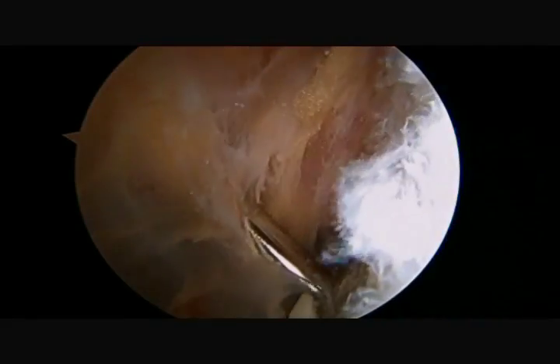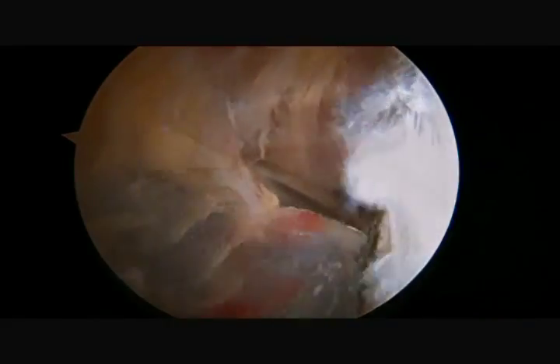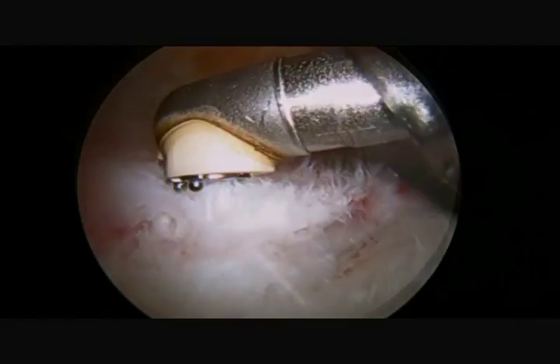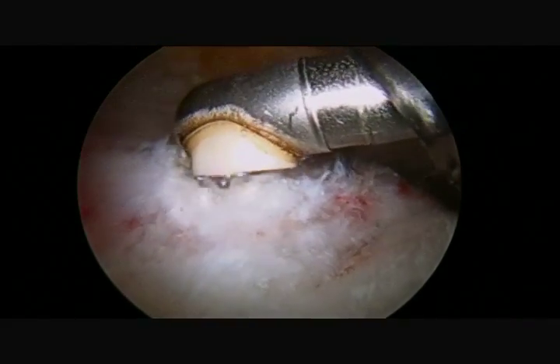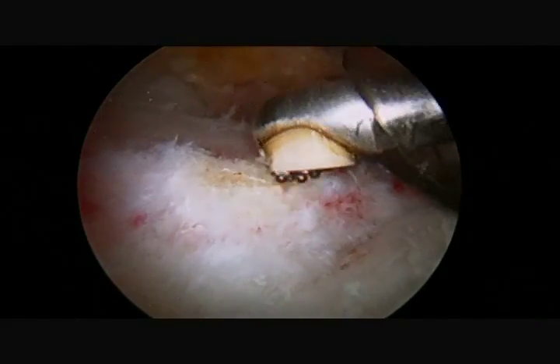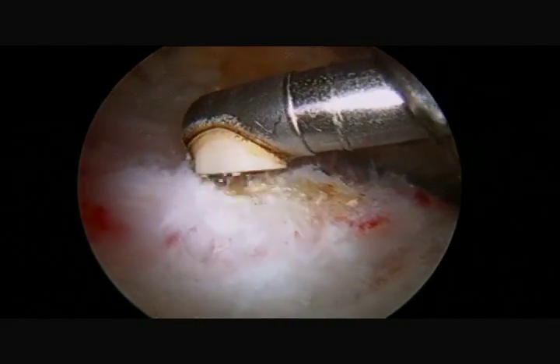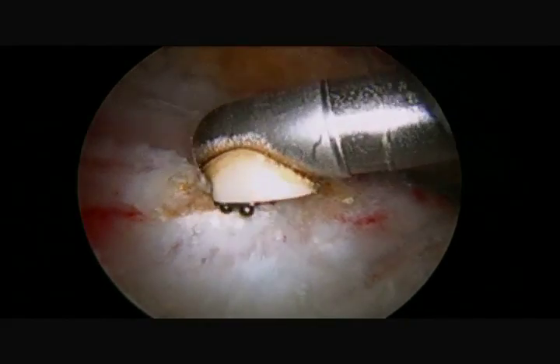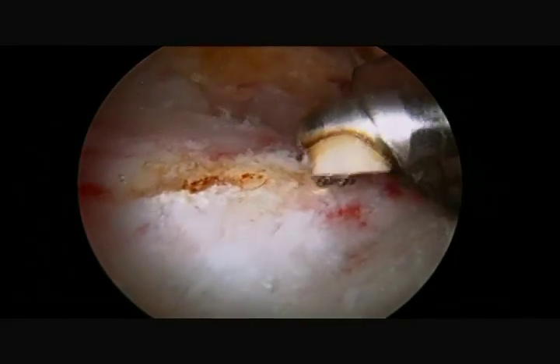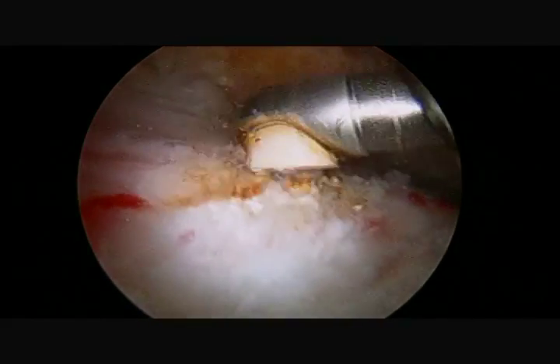An examination of the subacromial space is done looking for any debris that is floating around. Once found, it is removed. The rough edges of the rotator cuff that were created are then smoothed out with a vaporizing wand. Most patients notice dramatic pain relief within days of the procedure.